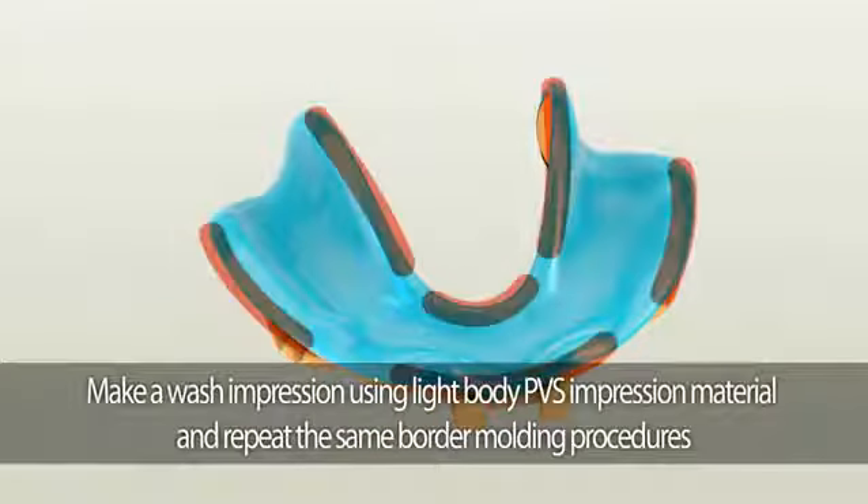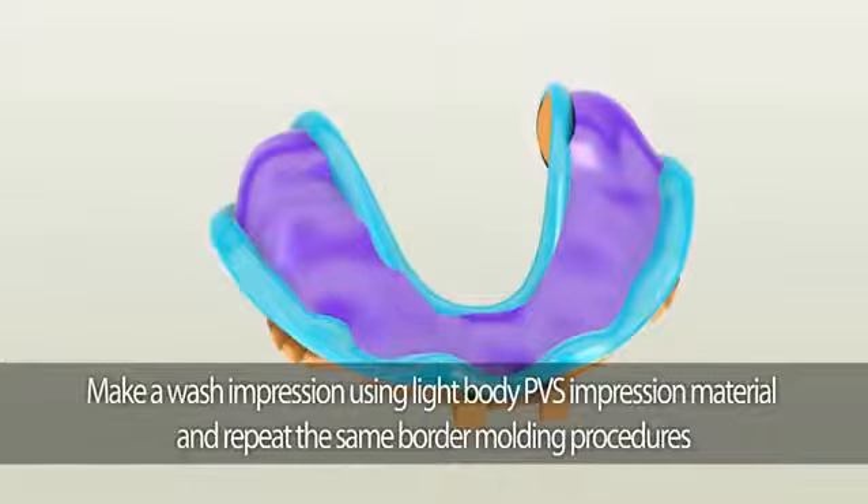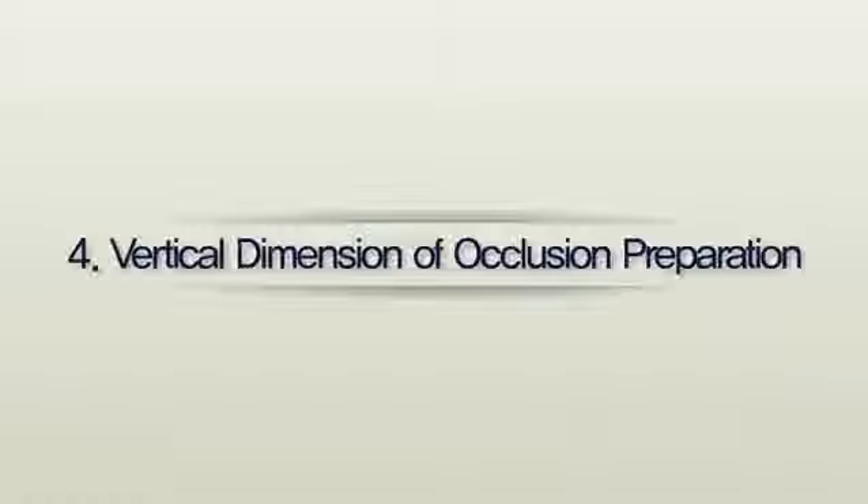The second area to check is whether all the landmarks are duplicated — this includes the pear-shaped pad, buccal shelf, lingual flange, and the frenum areas. To make the wash impression, we recommend using fast-setting light body PVS material. Lightly cover the entire area with fast-setting light body PVS material, then repeat border molding procedures.